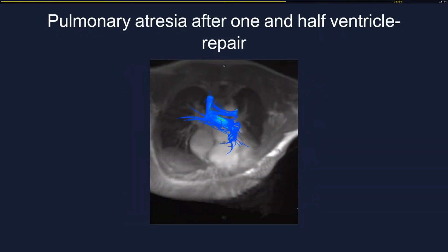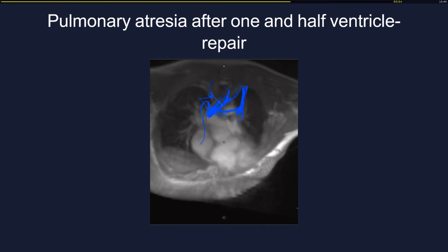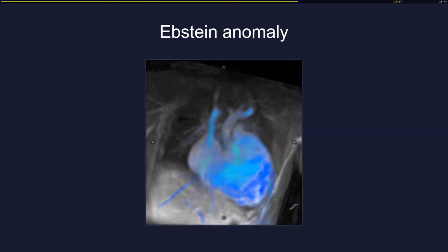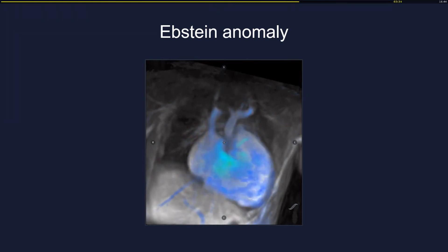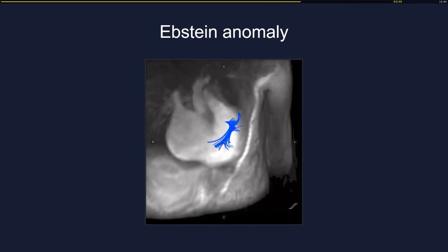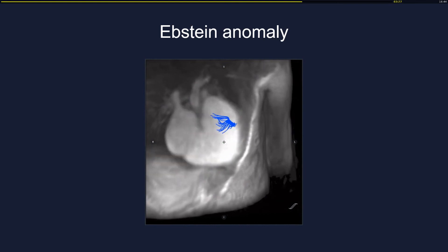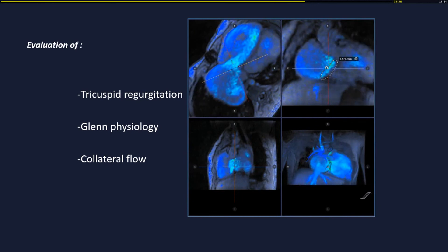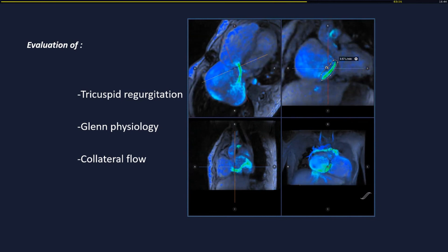You may also use 4D flow in more complex pathologies, for example the really challenging one-and-a-half ventricle repair for hypoplastic right ventricle — in this case after pulmonary atresia correction and then palliated by a Glenn shunt — and you may estimate and precisely calculate all the complex hemodynamics. These measurements are not accessible with CT scan or previous MRI techniques. Also with complex valvular pathologies such as Ebstein anomaly, the surgeon is really happy because you may study exactly the valve physiology with streamlines and anatomy. In patients palliated by a Glenn shunt, you may estimate tricuspid regurgitation, the physiology and volume of the Glenn, and collateral flow.